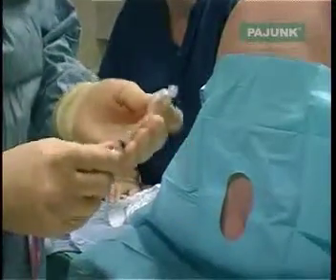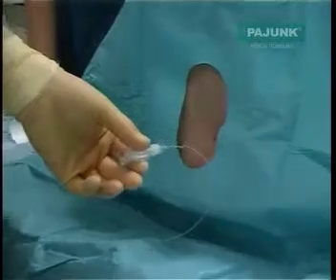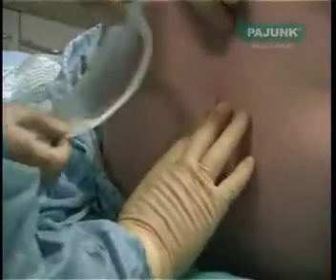The filter is then flushed with whatever local anaesthetic agent one is hoping to use in theatre, and that will depend on the position of the patient — if they're in a lateral position you normally tend to favour plain Marcaine so that the drug floats upwards. And the catheter is secured in the normal way.